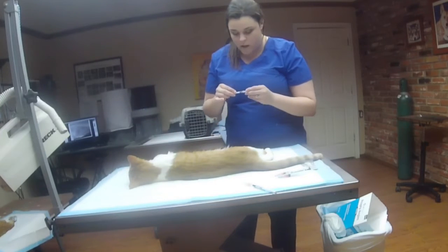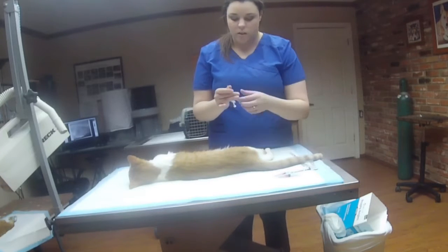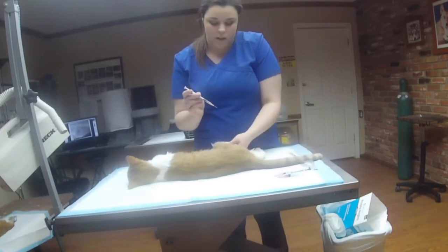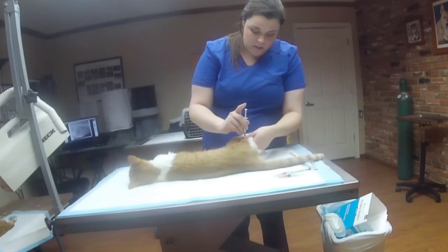And then for an intramuscular injection, you're going to want to go directly into the muscle. This is just saline solution. You go directly into the muscle and inject.